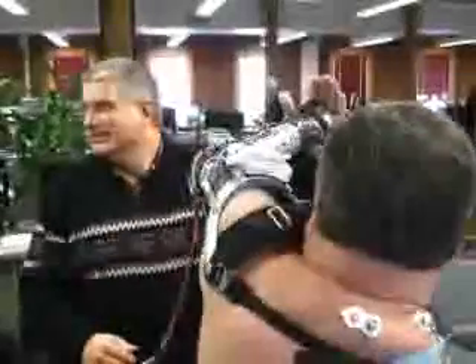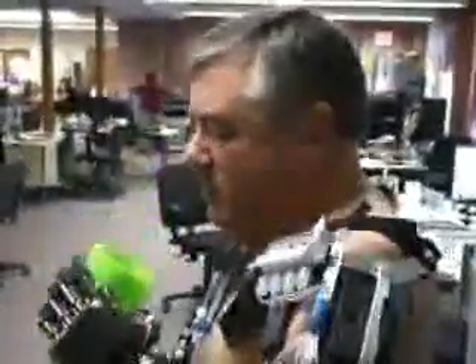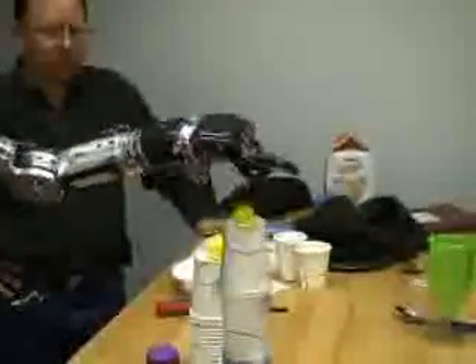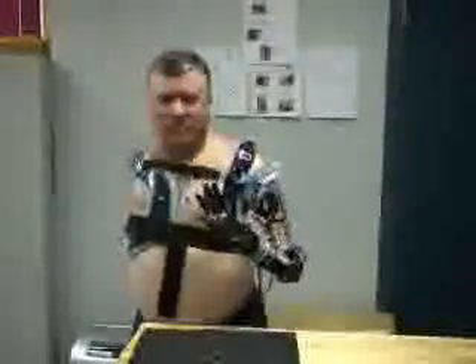The Luke arm also had to be agile enough to do exactly what the human arm can do. So far, the test pilots, within a matter of five to ten hours of practice, can operate the arm such that they can pick up small objects, stack cups, and even eat grapes. The arm handles these complex tasks because of the sophisticated electronics inside.